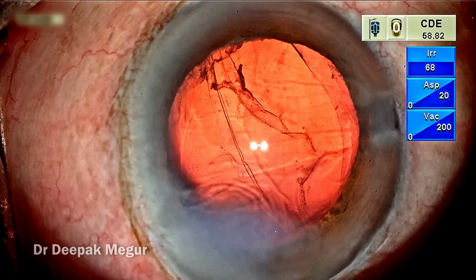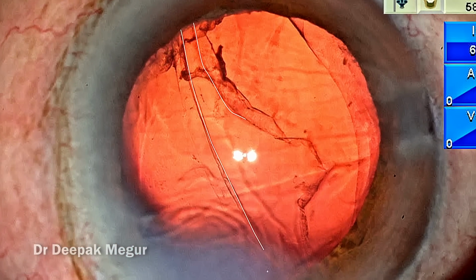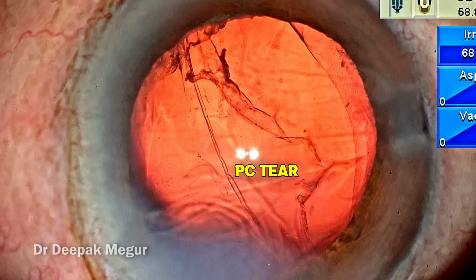So let me pause the frame here. I can see 2 distinct lines here, and I thought this in-between gap is the area where the PC is missing. That's what was my initial impression. And believe me, this impression keeps changing, so do watch out.